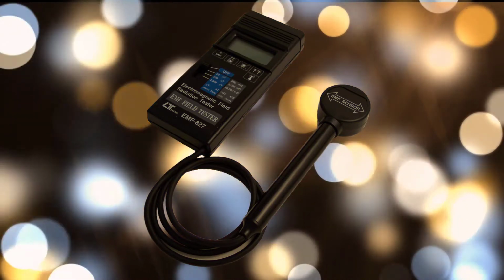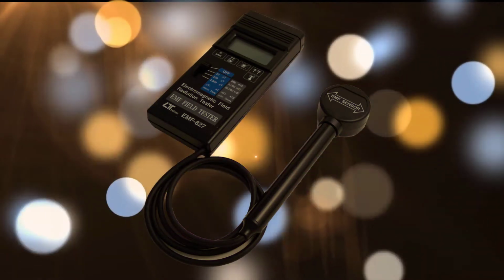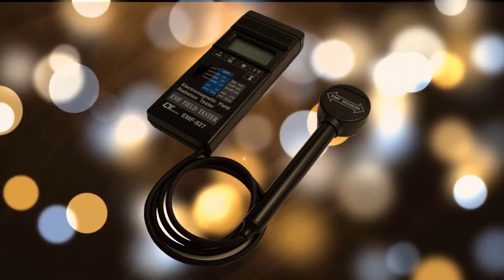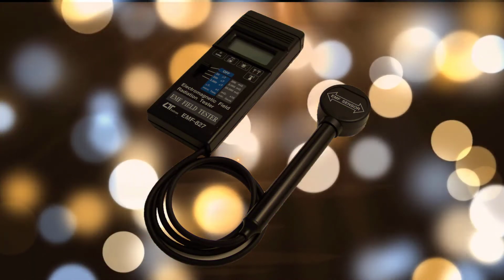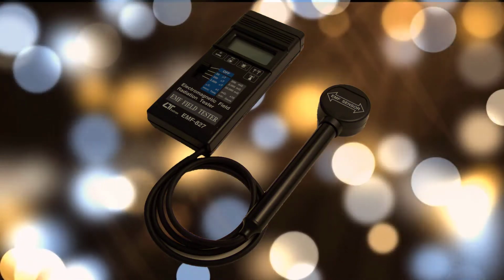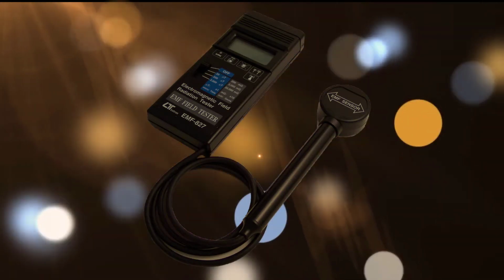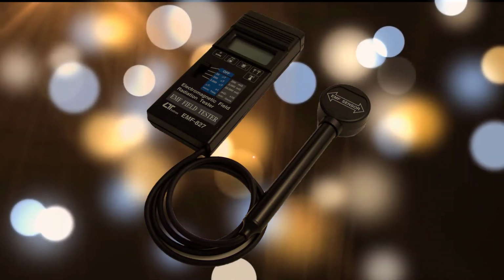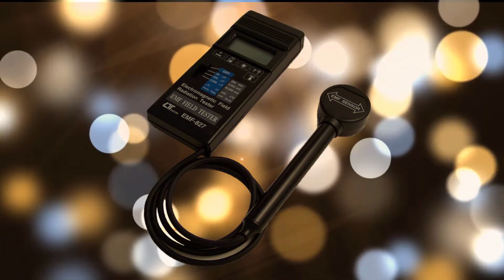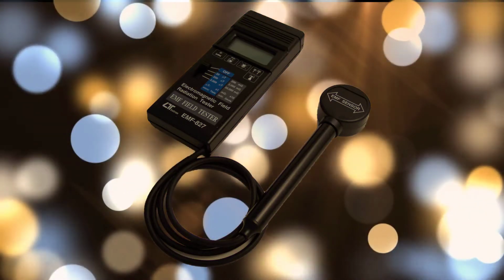Modern EEG systems are all about equally susceptible to a minimum level of these radiated sources due to the geometry of the head and the electrode cables. So, keeping the electrode cables close together helps minimize pickup of this type of interference to some degree. But the other factor you have some control over is the distance of the source from the location at which you are taking the EEG measurement. If you cannot move the source, at least the gaussmeter can help you find it and make an informed decision about how close to locate the laboratory to a known immovable source.